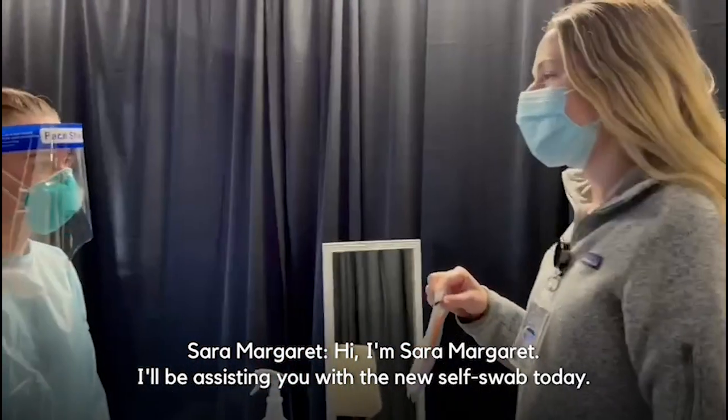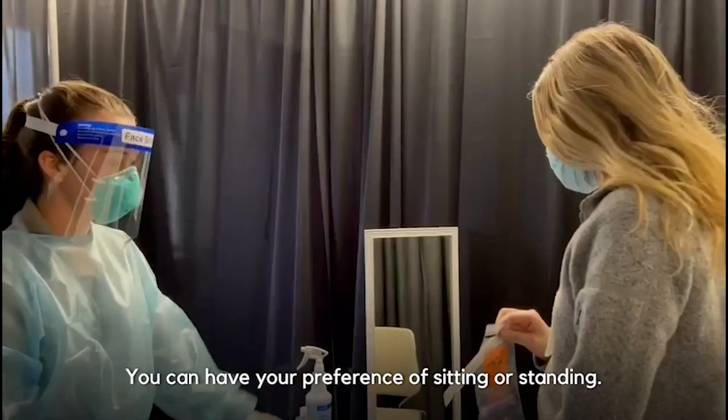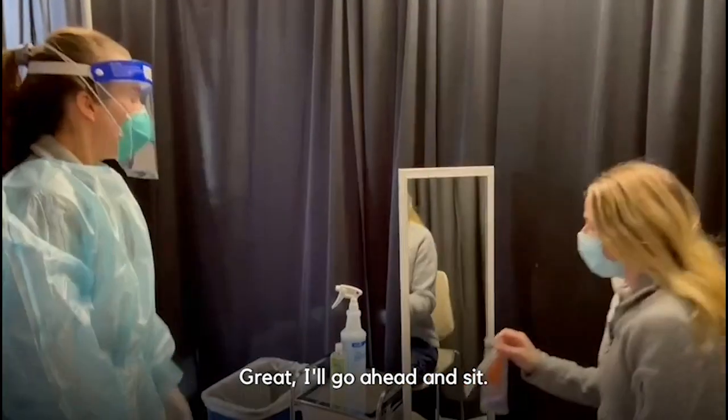Hi! I'm Sarah Margaret. I'll be assisting you with a new self swab today. You can have your preference of sitting or standing. I'll go ahead and sit.